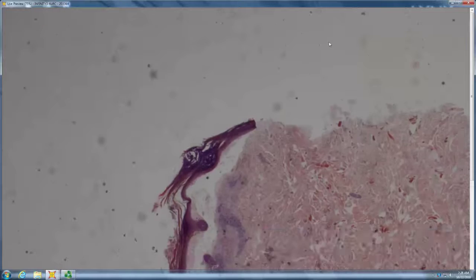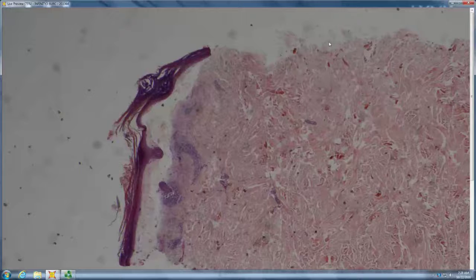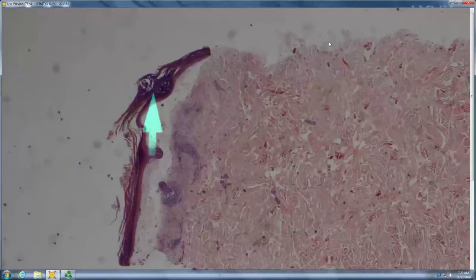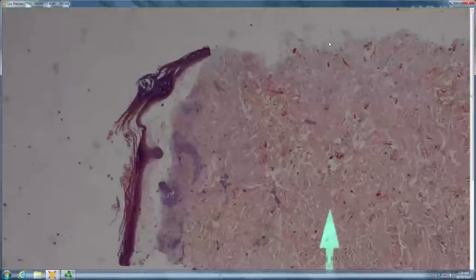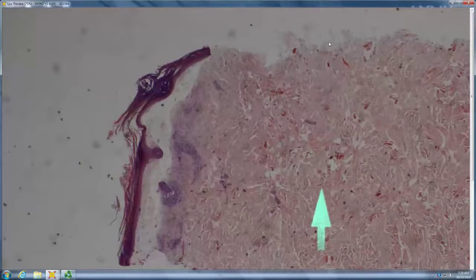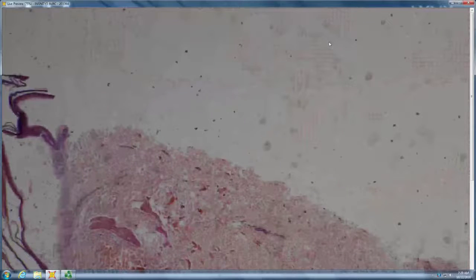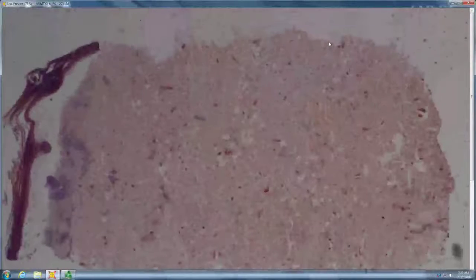So the papillary dermis looks like it either has edema or it's filled with something. And then below that I see some lymphocytes. So there's certainly dramatic hyperkeratosis, right? And is the underlying collagen, if this is trunk, normal or abnormal? I guess it's normal. Pretty much normal, right? That would be normal for trunk.